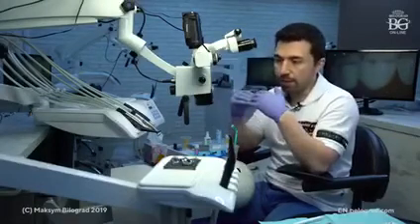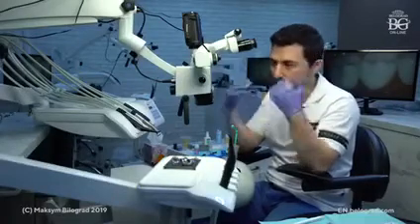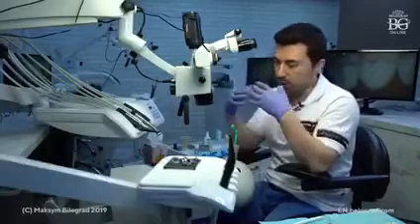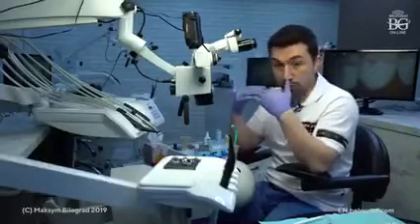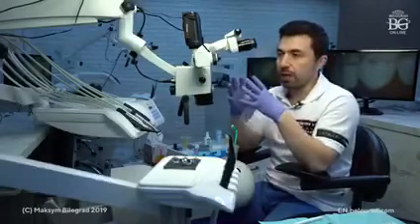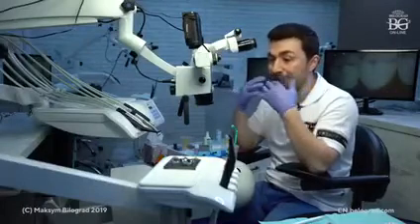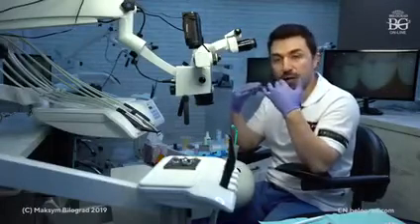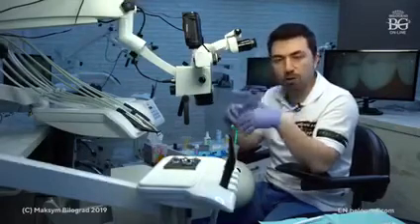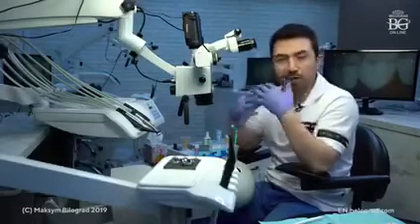So before the gum, supragingival, we prep in non-aesthetic zones, the palatal side, for example, or posterior teeth, when the smile line is really low and you are not able to see the gum area.